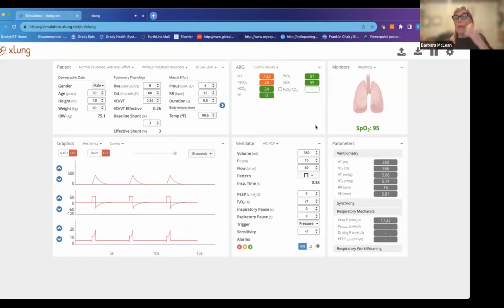that. Remember that if you have obstructive shock, let's say you have a pulmonary embolus, or you're using a lot of PEEP and you're compressing those pulmonary vessels, your patient will have dysynchronous end tidal and PaCO2. But in general, when we talk about ventilation, not perfusion, ventilation, end tidal CO2 and PaCO2 travel in the same direction. So you can see we look a little bit better here.